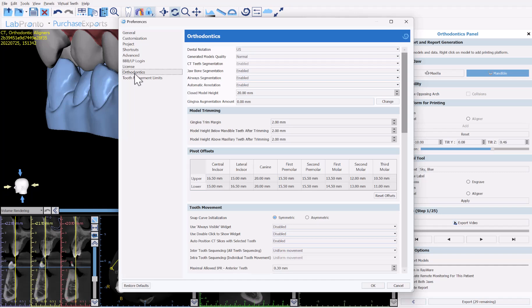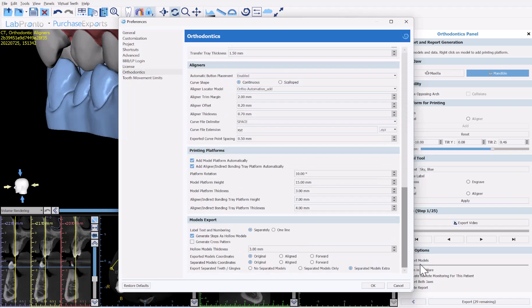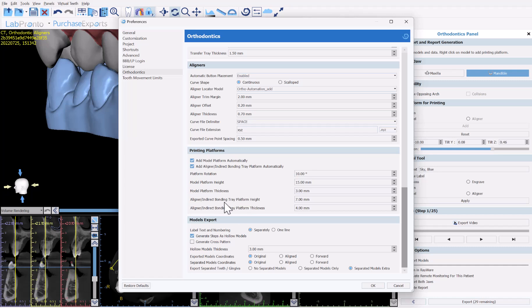Once positioned, click apply after choosing emboss or engrave, and the software will apply the text to all models for that jaw. Then switch to the opposing arch and do the same. In tool properties under orthodontics, scrolling to the bottom, we have a checkbox to add the model platform automatically, along with default options for platform rotation, height, and thickness.